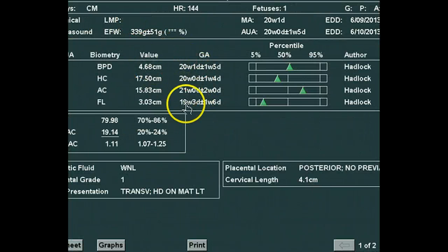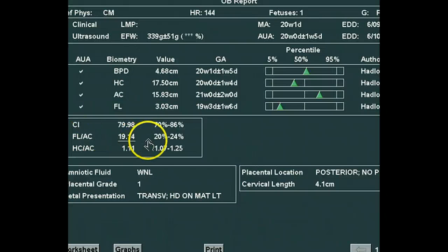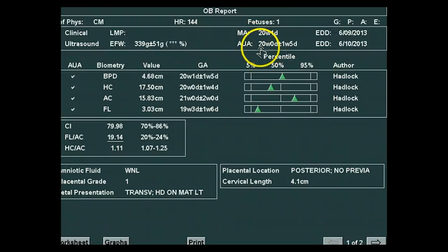All the measurements look pretty concordant. We look down here at our little femur length, AC 19.1, 20% is lower, so it's saying, all right, in relation to the abdominal circumference, the femur is a little short. Well, the abdominal circumference is a little big. We know we kind of over-measured it. The femur is a little bit shorter, but most of the time when you see that, it's actually due to just a short parent.